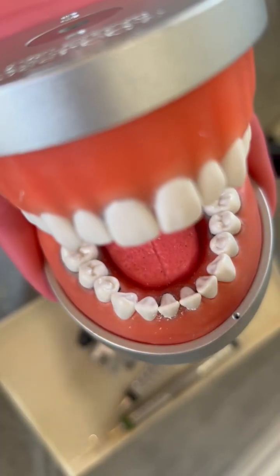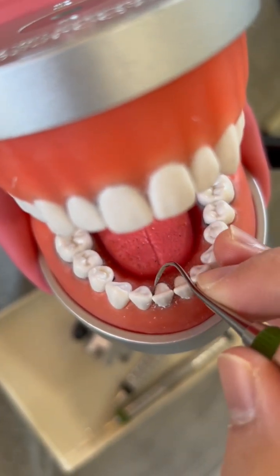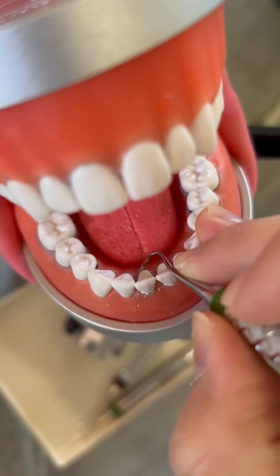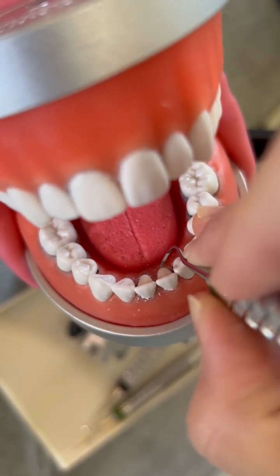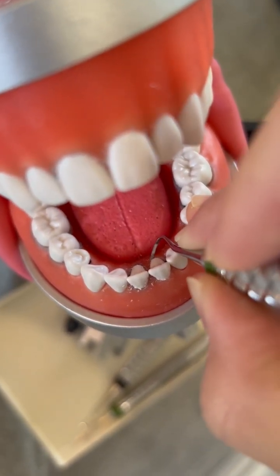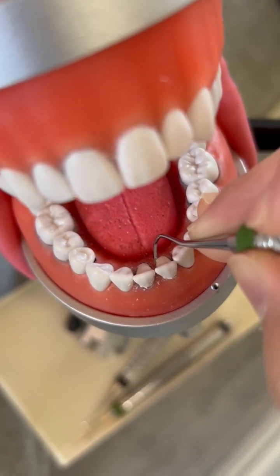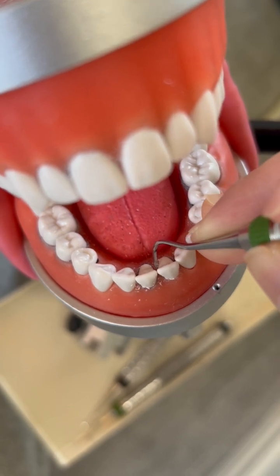And then I will work on the lingual sides. At that time, I will use the secondary blade. Start at the midline, side to side, pivot and roll, side to side, pivot and roll. Only go half of the interproximal space.